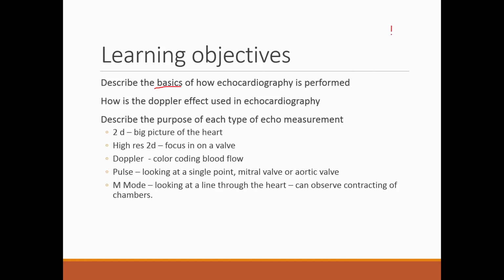So Dr. Katz started talking about how you shoot some waves at an object, and then they get reflected back. The waves are collected by a receiver, and then there's really sophisticated software that turns that into a picture.